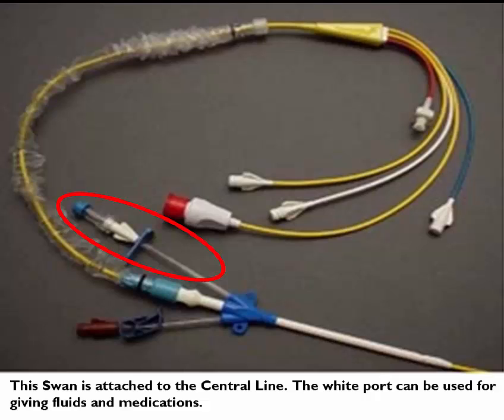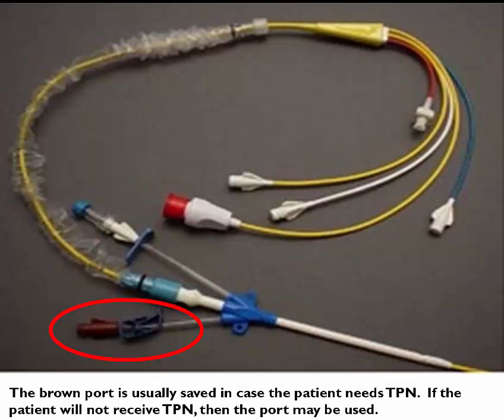The white port can be used for giving fluids and medications. The brown port is usually saved in case the patient needs TPN. If the patient will not receive TPN, then the port may be used.